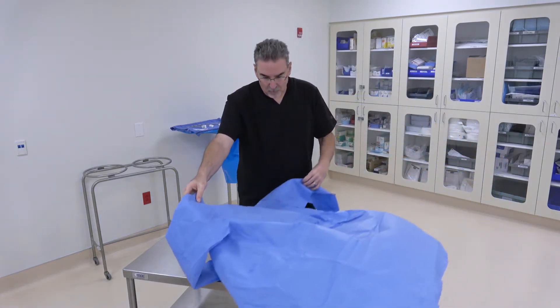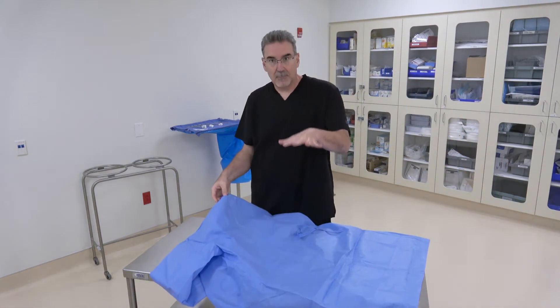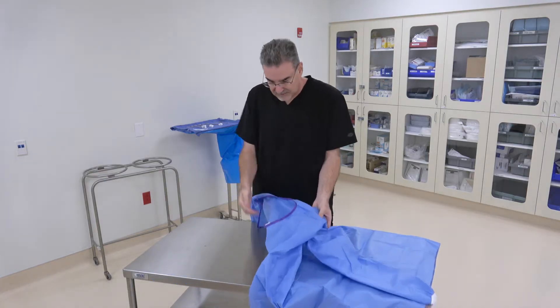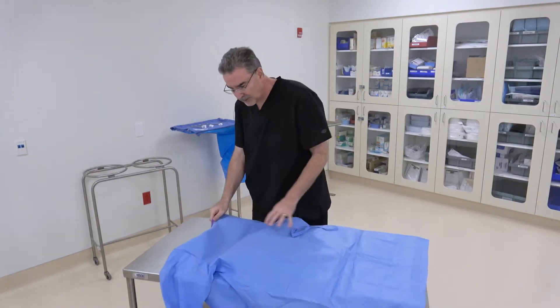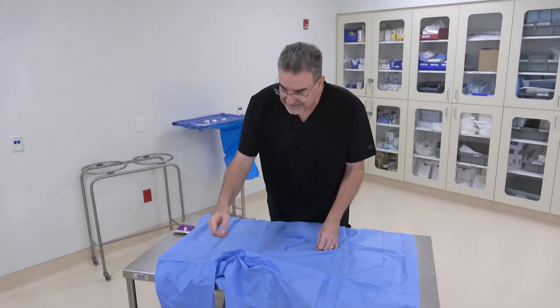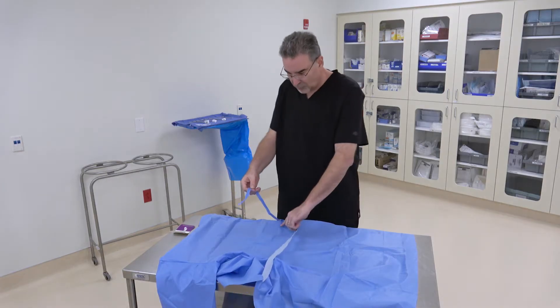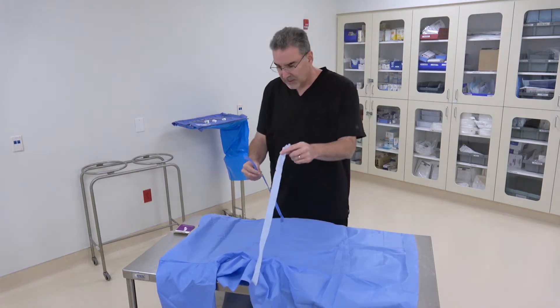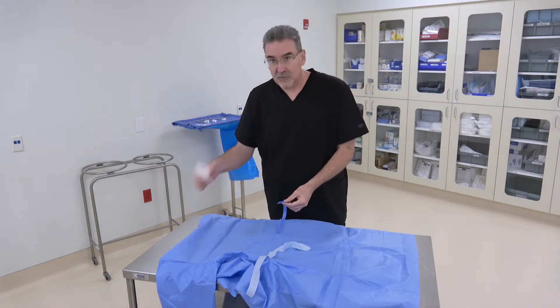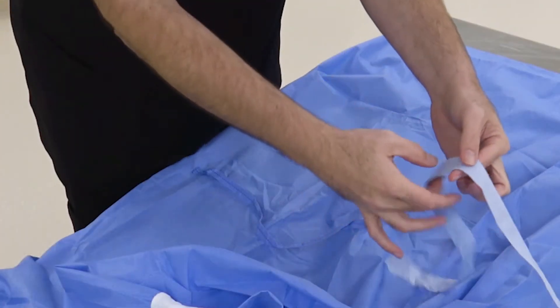The first thing we're going to do is lay the gown down with the back side up. This is the inside, where your body would go. Then we want to find the longest and the shortest ties. Here's the longest tie, and here's the shortest one on the back of the gown itself. We're going to bring these together and use our card to put them together.